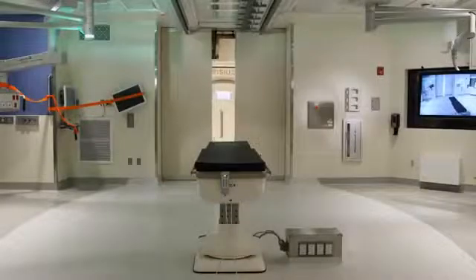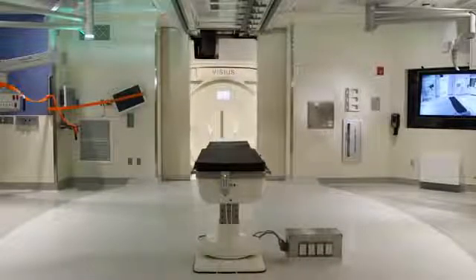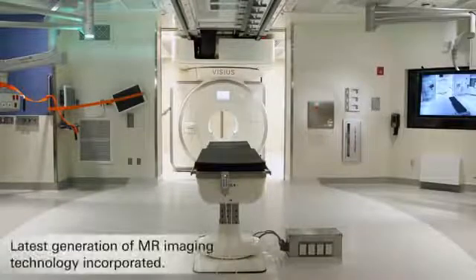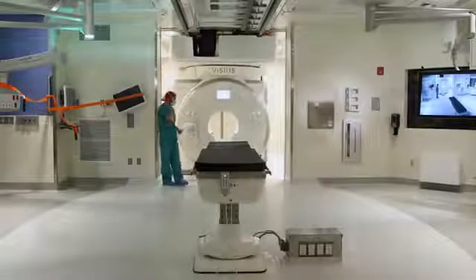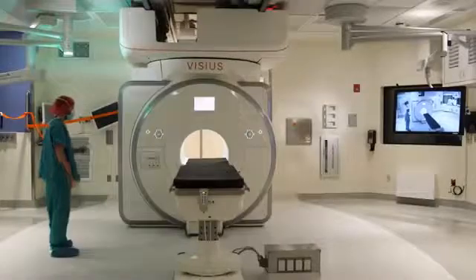This is really exciting to Dartmouth Neurosurgery, that much of the work that our faculty and our residents have participated in for a long time is going to be enhanced and facilitated by having this capability here. Our research interests have had to do with computer-assisted image-guided surgery, essentially navigating in the surgical field. And to have intraoperative imaging like intraoperative MRI and intraoperative CT enables you to enhance that computer ability. It lets us do more things with navigation, and it lets us validate much of the work that's been done.